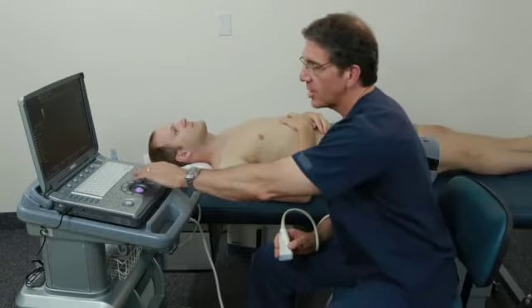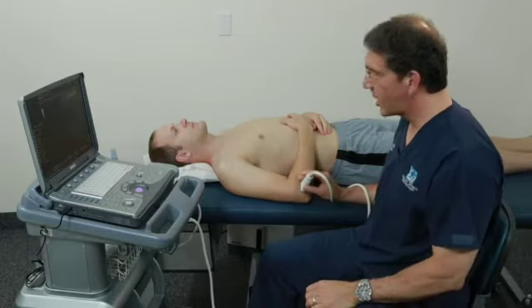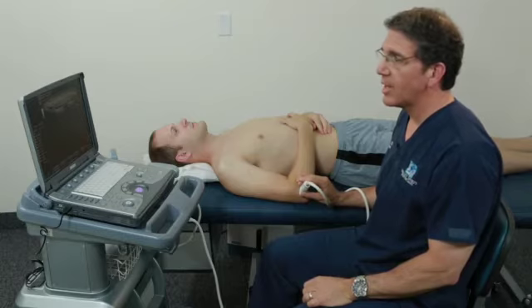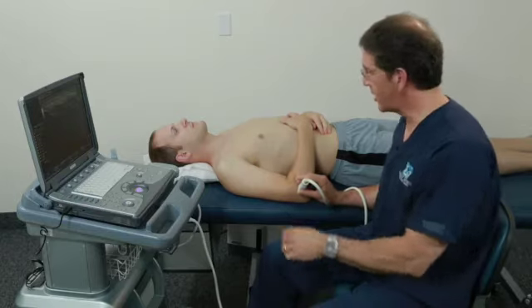So in this case, let's decrease our depth down to about 2 centimeters. Now when we put the probe down, we see that that image fills more of the screen and we have a better image overall. Now let's compare that to looking at the biceps tendon.